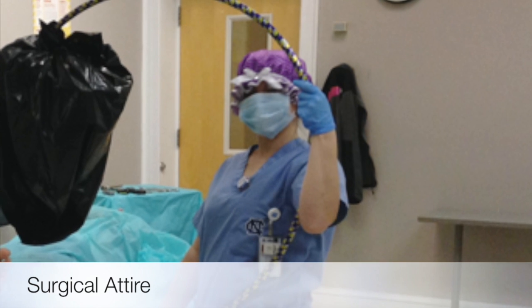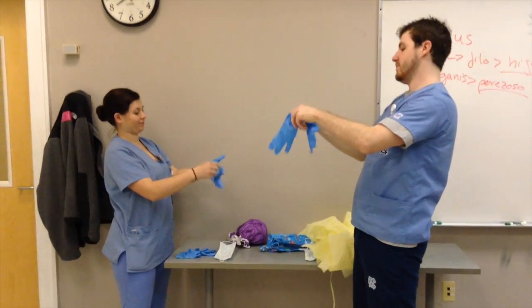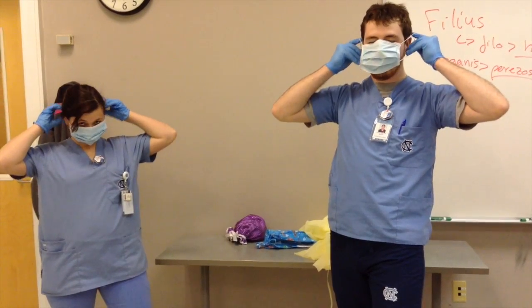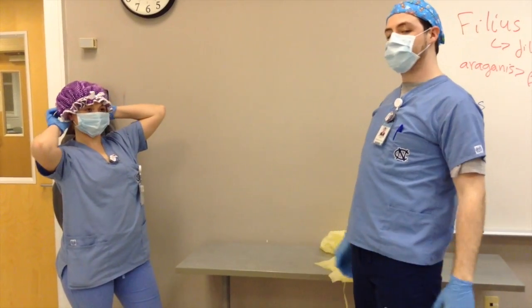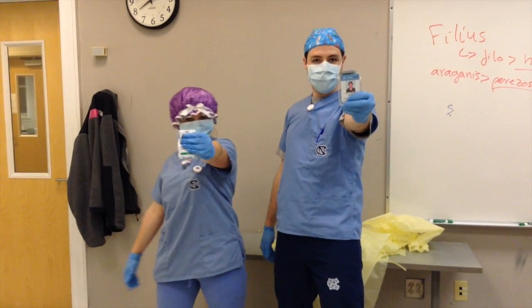Surgical attire. The OR team is expected to wear a clean set of surgical attire when beginning each shift to reduce the potential of contamination. Protective eyewear, shoe covers, and gloves should be worn if there is a possibility of coming into contact with patients' body fluids. Masks should be worn at all times in the operating room to protect the patient and the worker from cross-contamination. Caps should always be worn in and around the OR to contain the team member's hair. Radiation and ID badges must be worn at all times to track radiation dosage and verify the employee's identity.